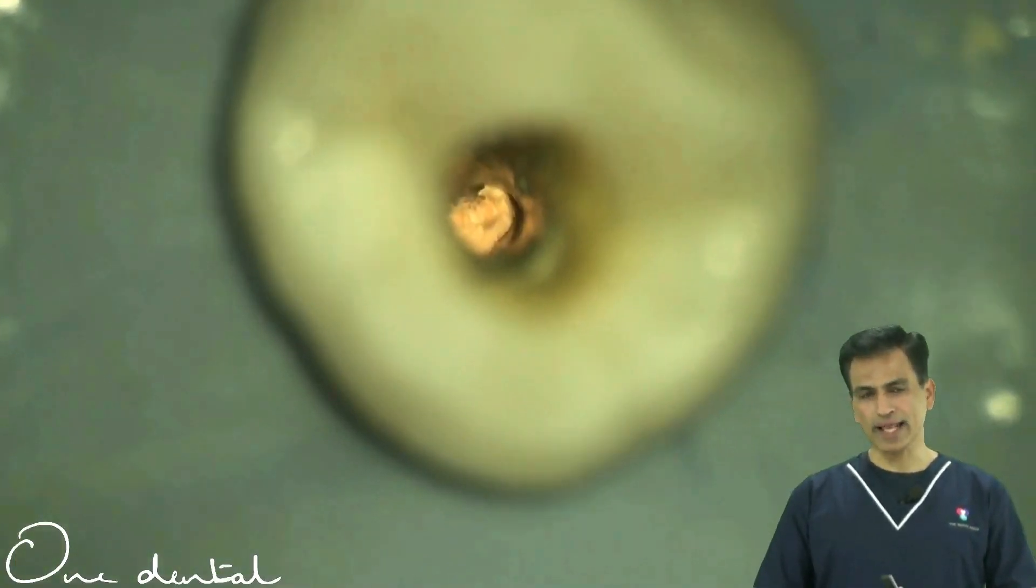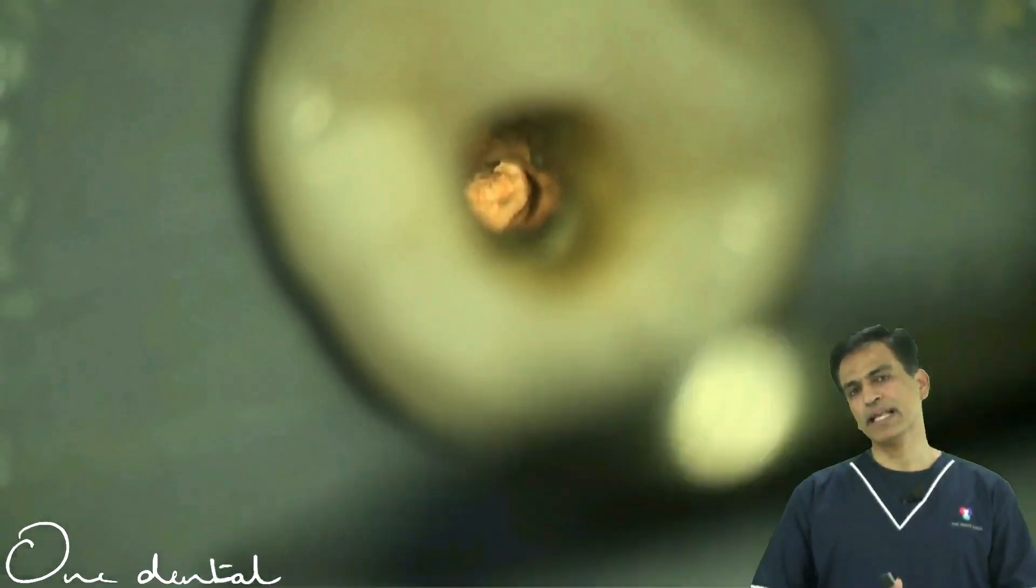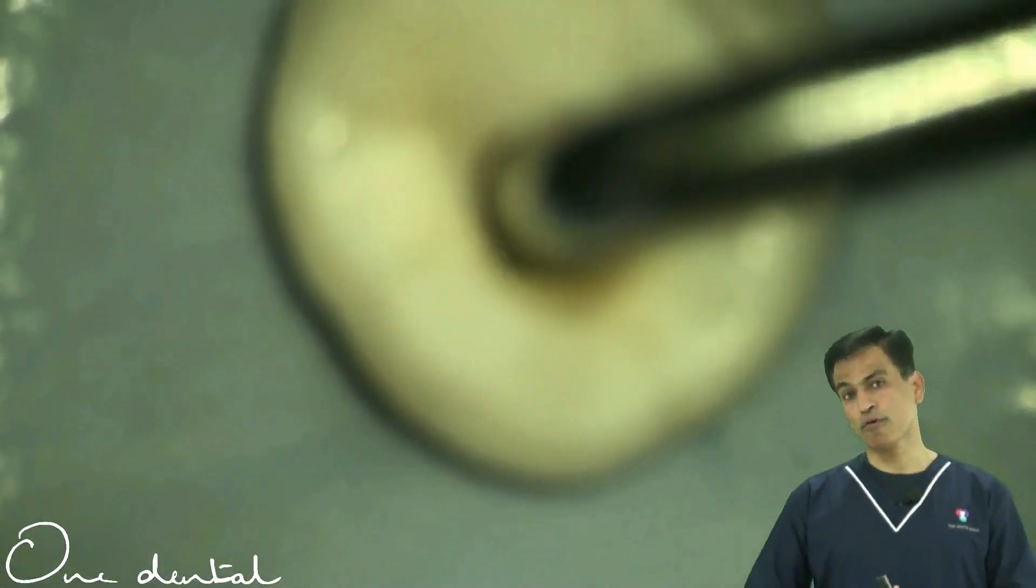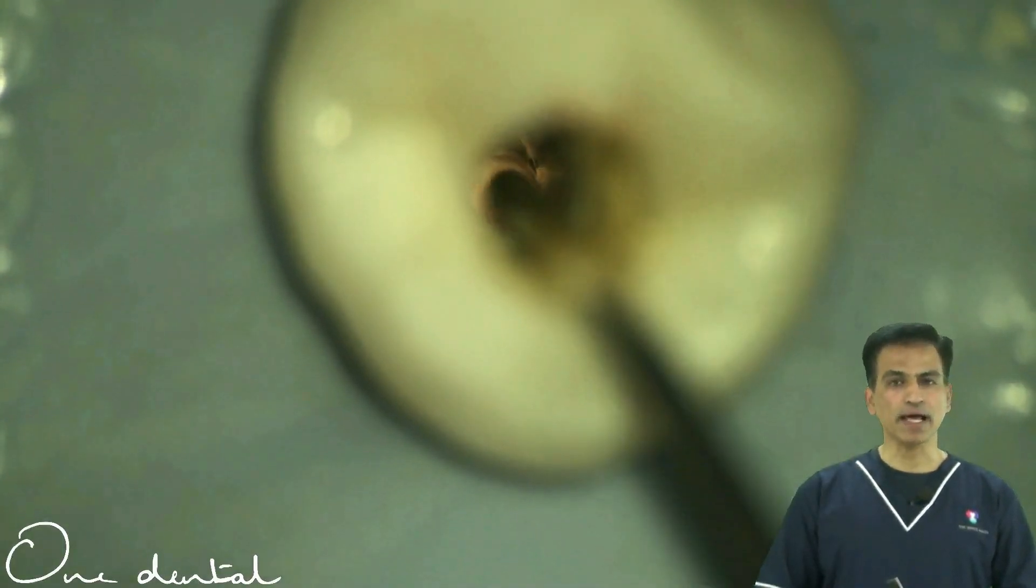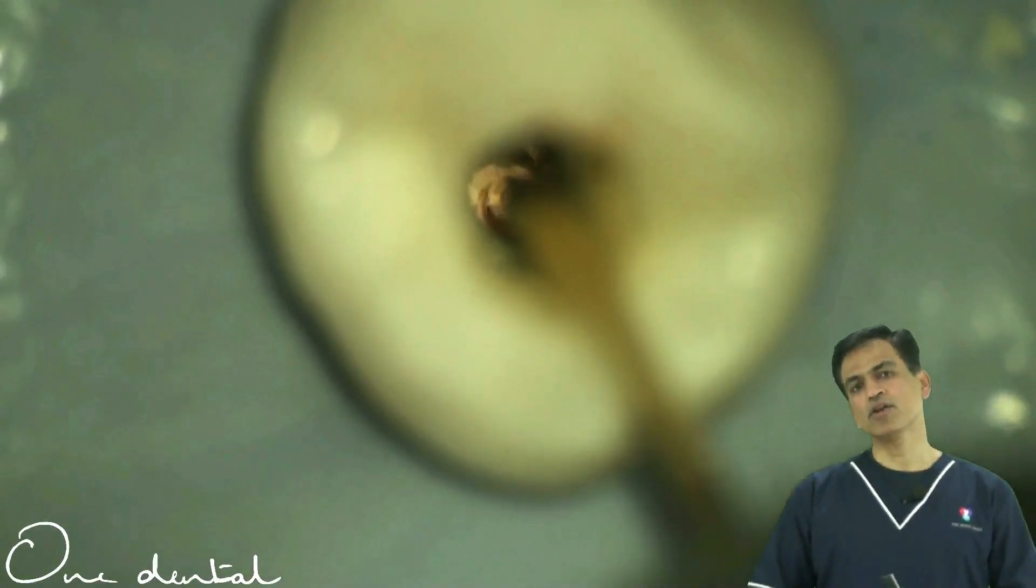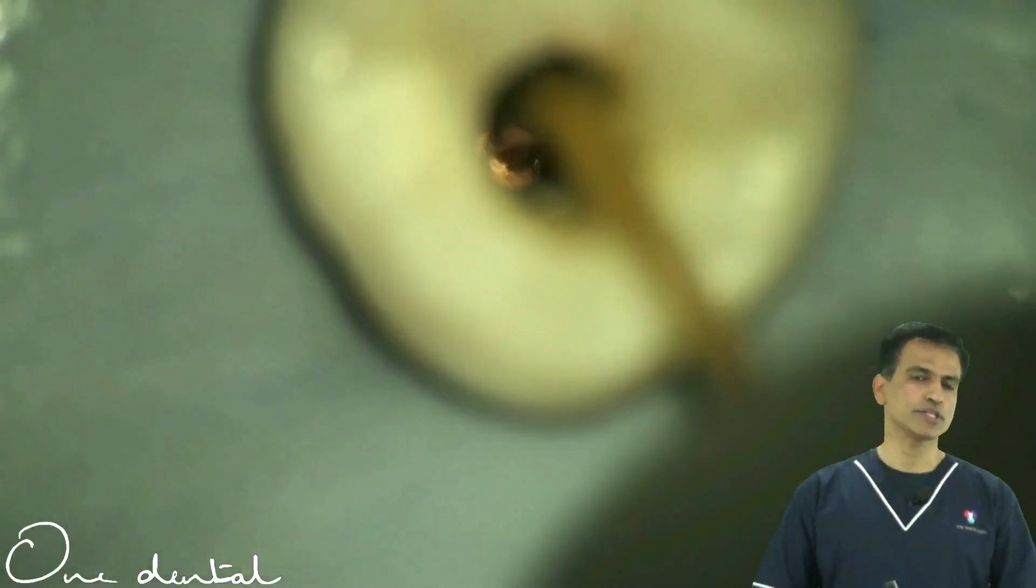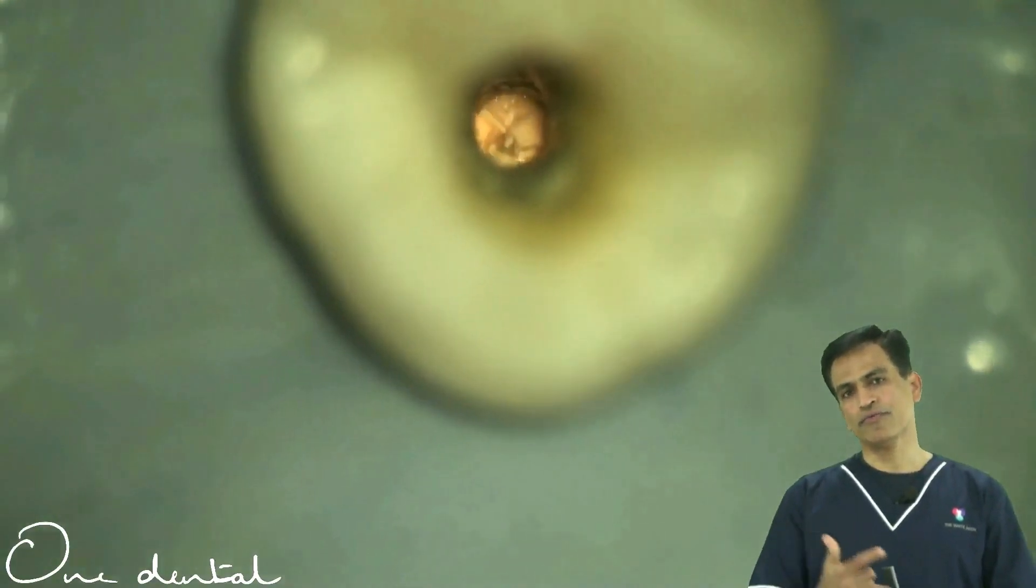It's the same gun that you carry up to the apical end, maybe a millimeter or two shorter. Deposit a little bit of flowable gutta-percha, use a right size of pluggers. Very gently you will compact it and try and settle the gutta-percha to get a good cross-sectional diameter of the canal to be filled with.